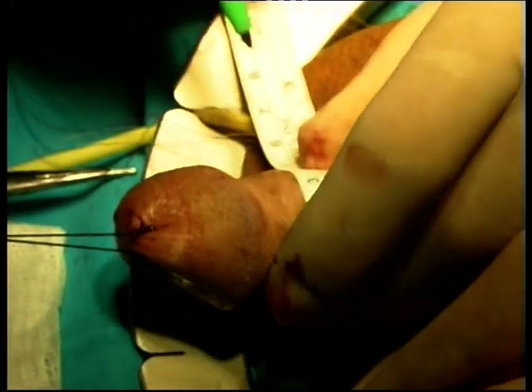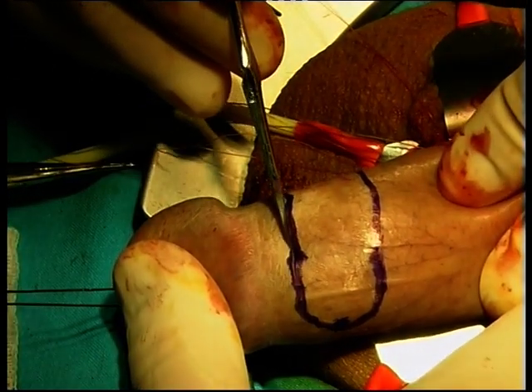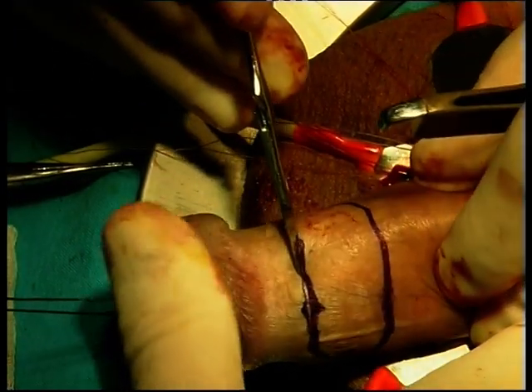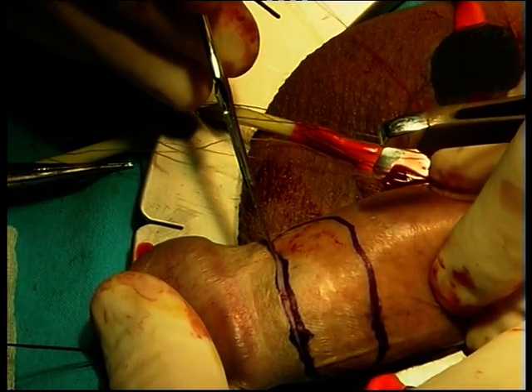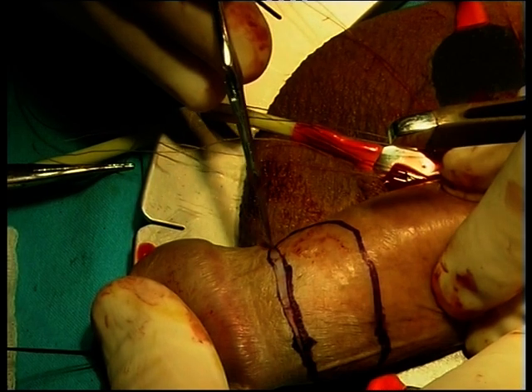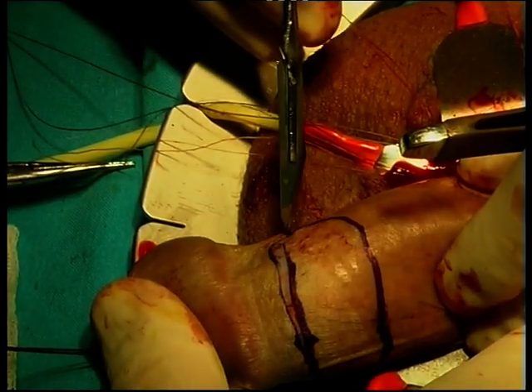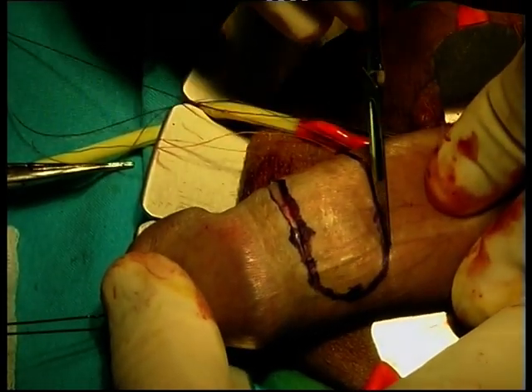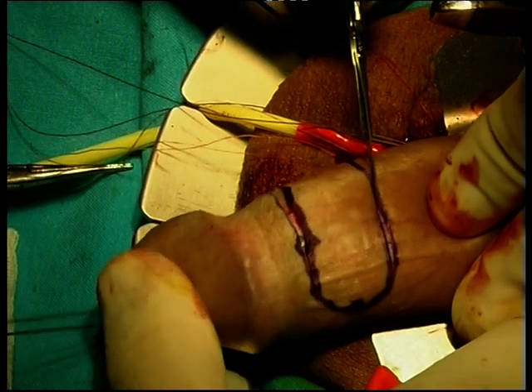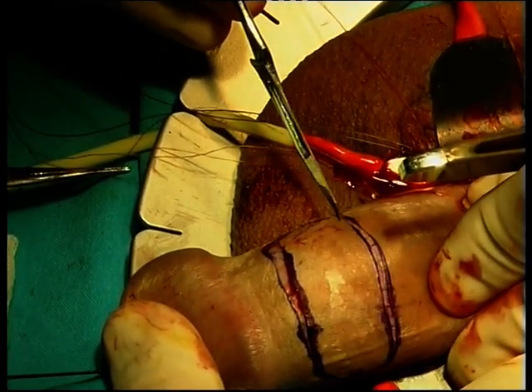When harvesting the graft, one should keep in mind that the final length of the graft will be approximately 30% longer due to the elasticity of the preputial mucosa. It is also important to remember that the graft suffers some contraction over time, especially in its transverse diameter, of about 25%. The donor site is incised superficially to harvest the graft with the least possible amount of subcutaneous tissue in order to shorten the defatting procedure afterwards.